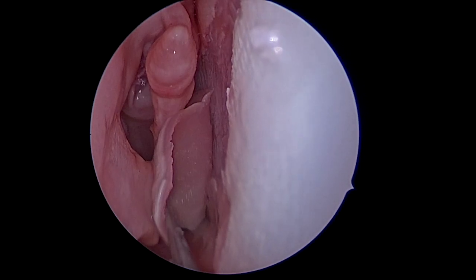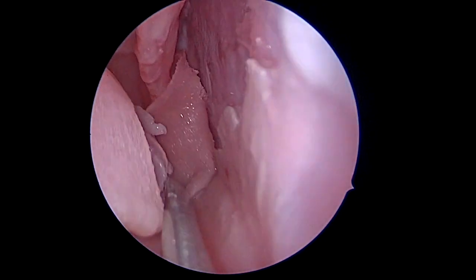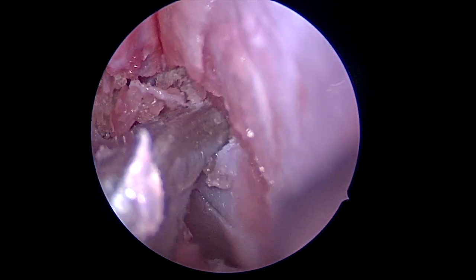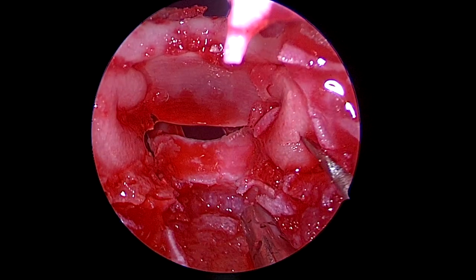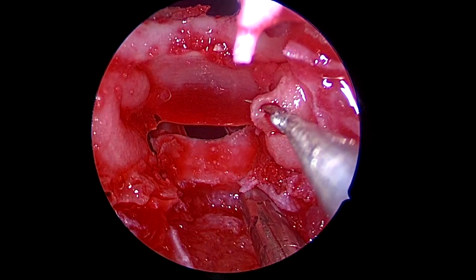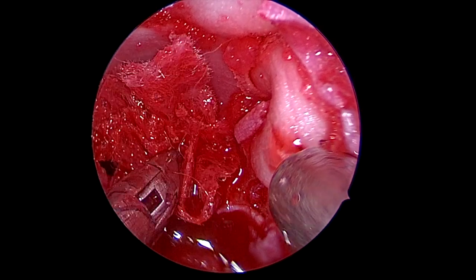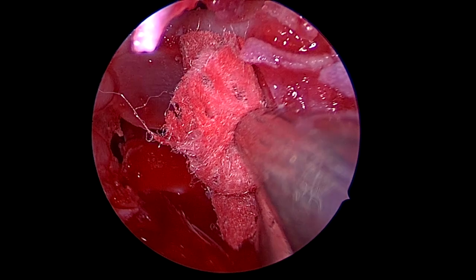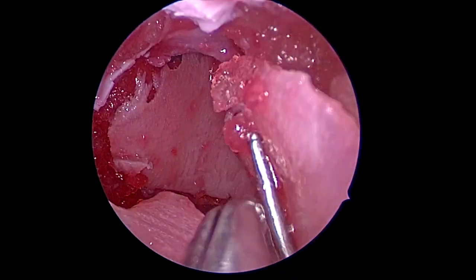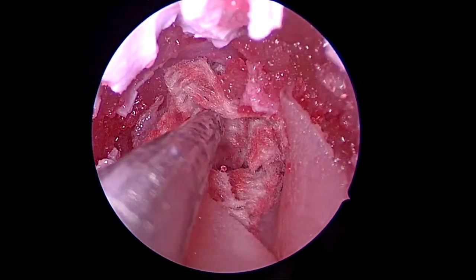We also now have models that have tumors, such as this pituitary tumor case with the carotid artery in it. After raising a septal flap, we then open up the sphenoid sinus. We've identified the carotid artery and an injury is made into the carotid. Significant bleeding is seen. The skills of the operator control the blood flow, then place the muscle patch over the injury site to control the bleeding, and then the septal flap is placed over that and supported by nasal packing.